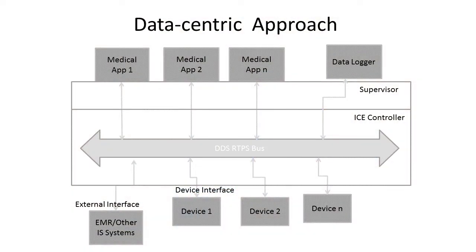Why are 19 people a day dying from a PCA overdose when all you have to do is pause the pump? They're not going to die if they don't get morphine. But right now they're saying, well, we can't do that. There's no way to do that going forward, because you don't have the capability of understanding, and enough data around the rest of the system, to know that it's actually morphine in that infusion pump. So you can pause it and it's okay.